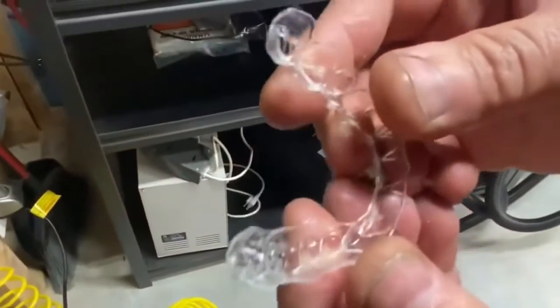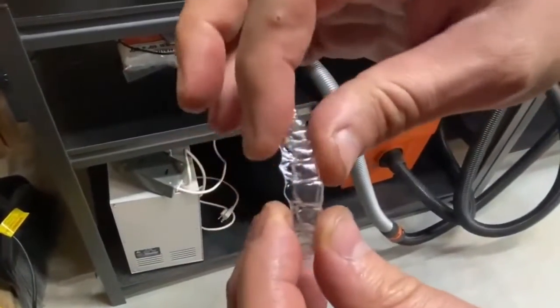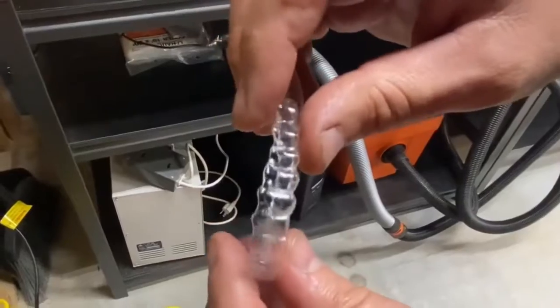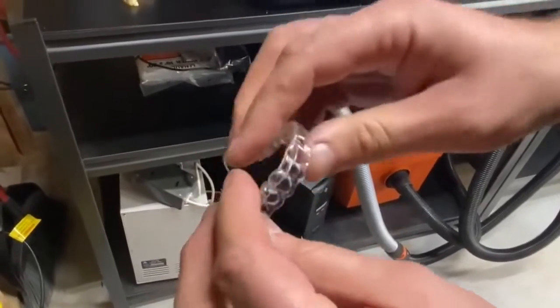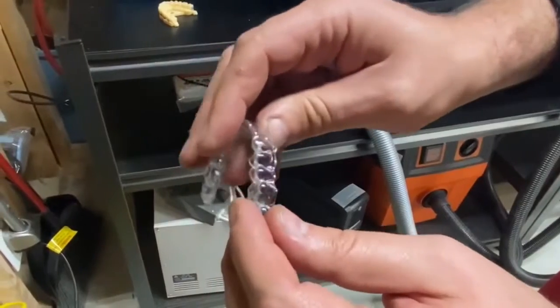Perfect. You can see the edges and the thinness. This is a little jagged or scallop line the way we designed it, and it looks pretty darn good. It doesn't feel sharp at all, so it's kind of ready to be inserted. However, our quality control will still want to polish, no doubt.